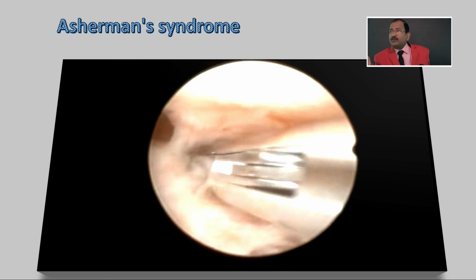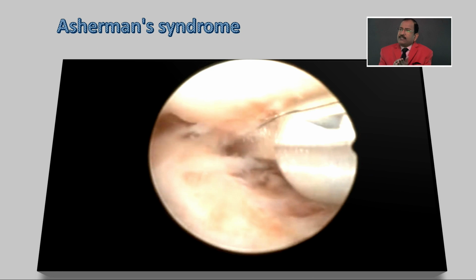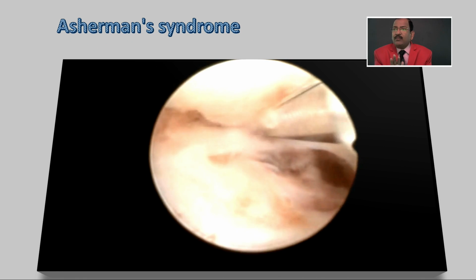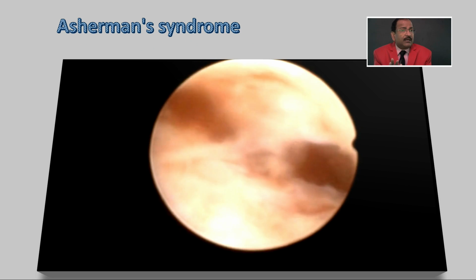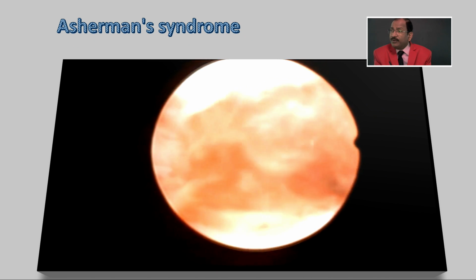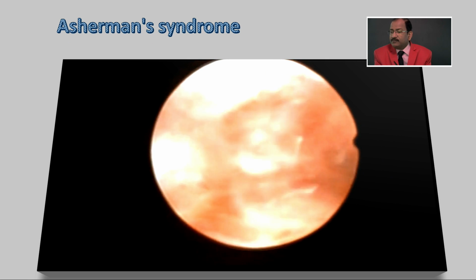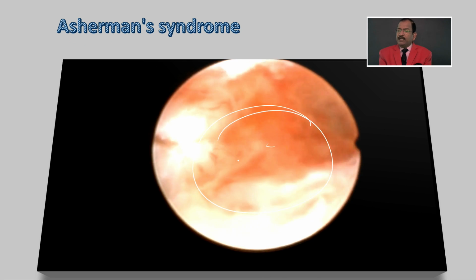If you are doing laparoscopy, then it's okay. Otherwise, if you are doing it and suddenly it collapses, that means your pressure is lost. Why is pressure lost? Fluid has leaked into the abdomen, and then you should not continue further. If you further continue, you will do a blunder, because you can perforate the bowel, you can make a big perforation and there will be a big problem. So be careful. And this is a large cavity now, and you will enter.